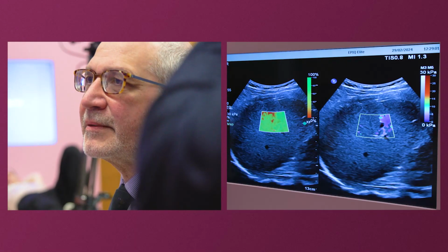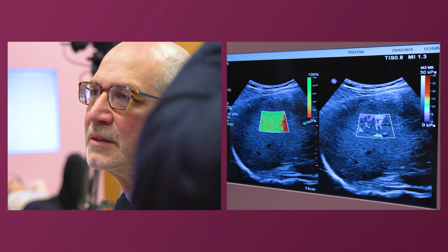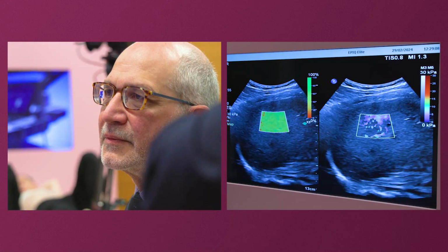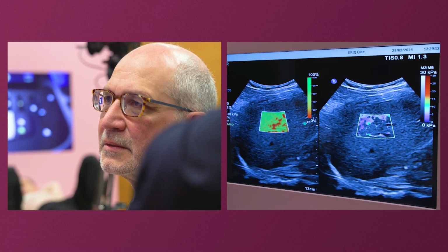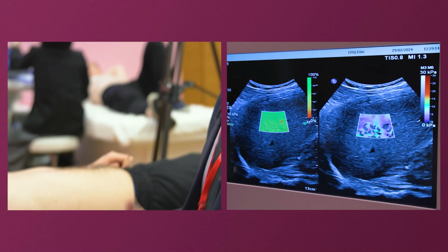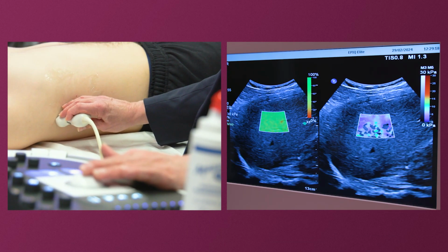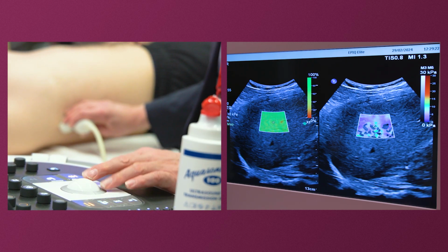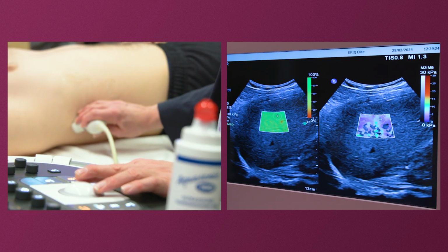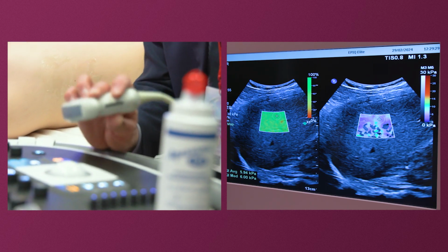Okay, just stop breathing there. And breathe away. And stop again. Okay, there you are. All right, and this you got. And you can scroll until you think, oh, that's a good image. Then you can measure. Also circle. Yeah, you circle, measure, and then you want to put it here. Yeah, which is the best. And then you get the consistent reading. 6. Okay, depends on the number.